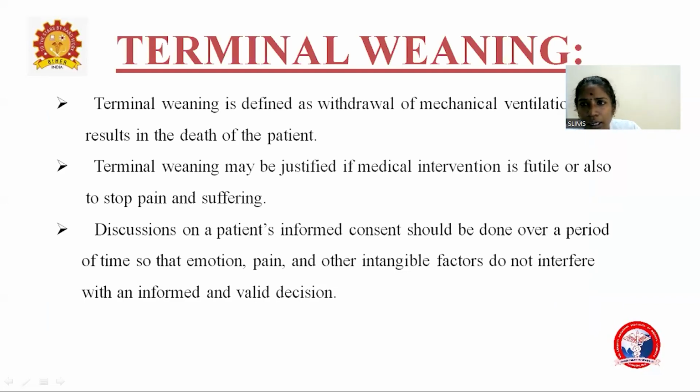And finally, termination from the weaning. Terminal weaning is nothing but withdrawing the mechanical ventilation, which can result in the death of the patient. Terminal weaning may be justified if the medical intervention is futile, or also to stop the pain and suffering. So this is one more new entity, that is terminal weaning. Discussions on the patient's informed consent should be done over a period of time so that emotion, pain, and other intangible factors do not interfere with an informed and valid decision.